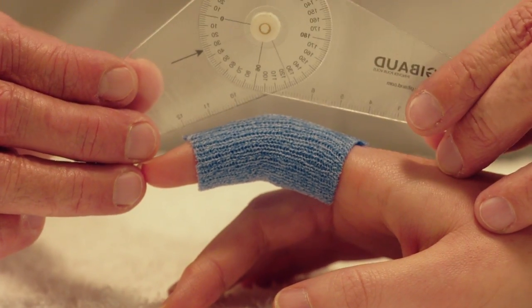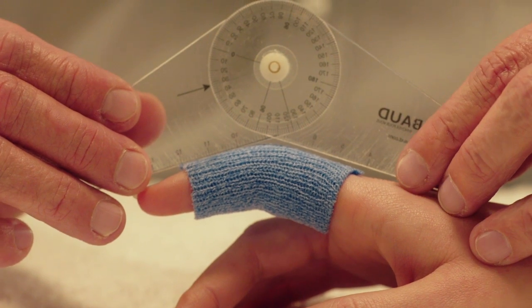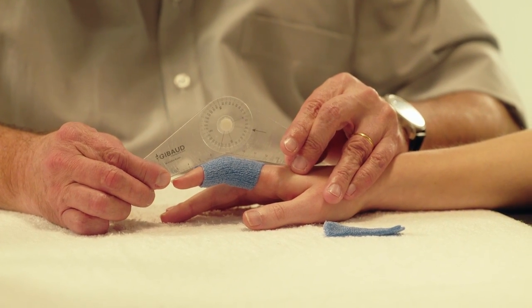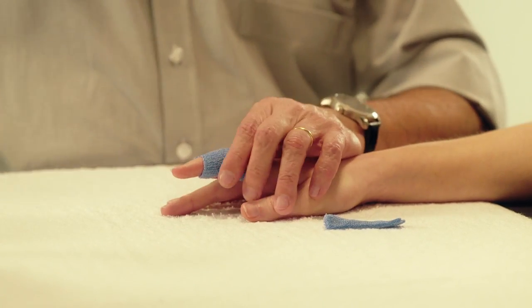Flex the PIP joint of the finger in 30 degrees flexion during hardening time. Verify the correct position of the PIP joint with a goniometer.